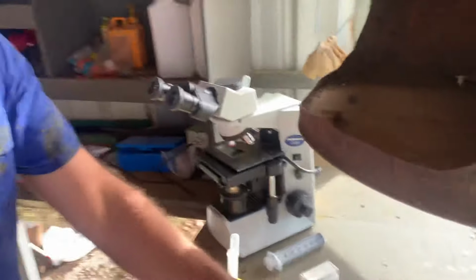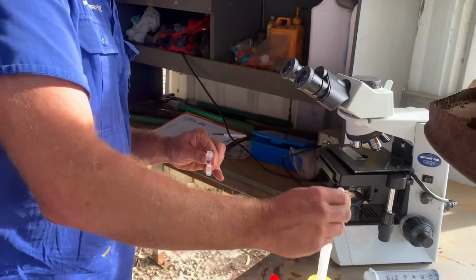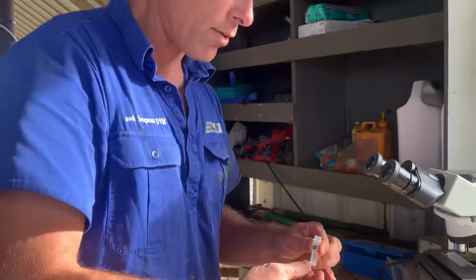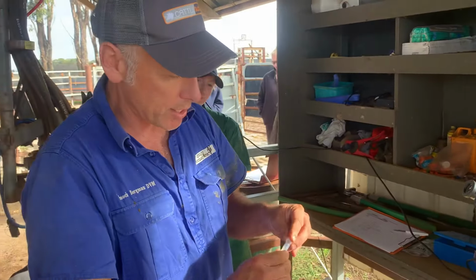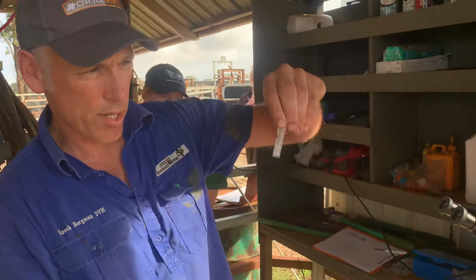Okay, so now we do need to do our morphology. We've got our stuff here that lovely Tegan's already prepared for us, and this will get sent off to be looked at under microscopy. So we know that they're swimming in the right direction. We've worked that out. Now we need to know if there's anything actually in the taxi. The taxis are going to the airport, and this is whether or not there's anything in the taxi.